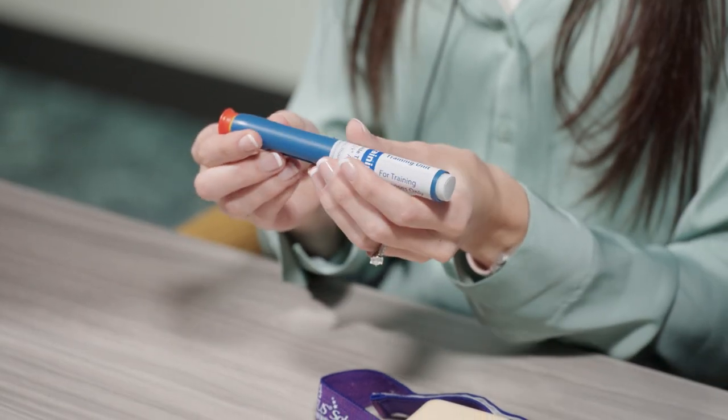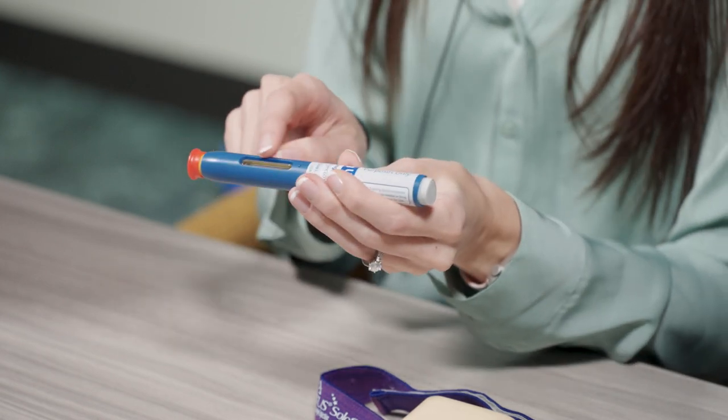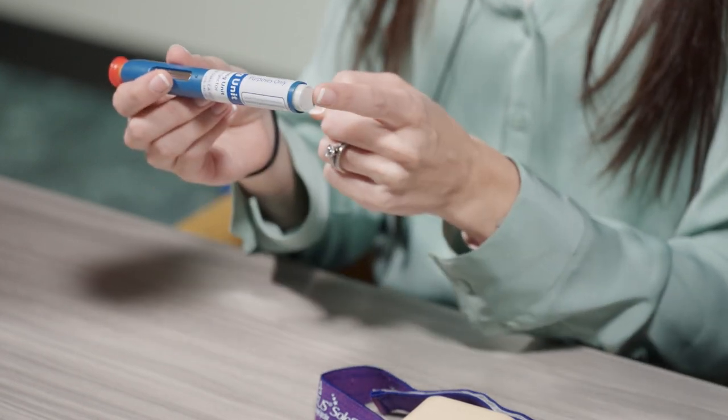Let's talk about the device components. It comes with an orange cap, a yellow safety guard which is the needle inside, a window with clear medication inside, an expiration date, and a gray start button.